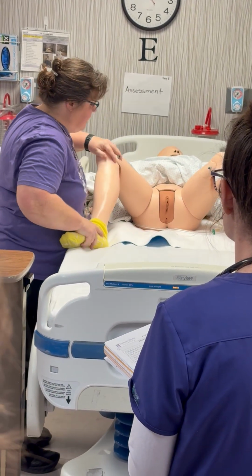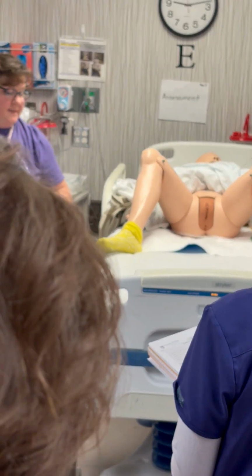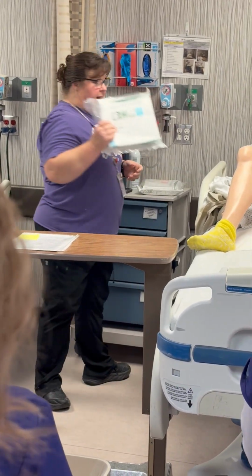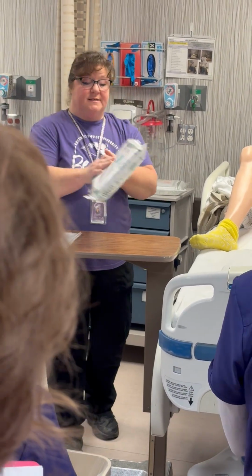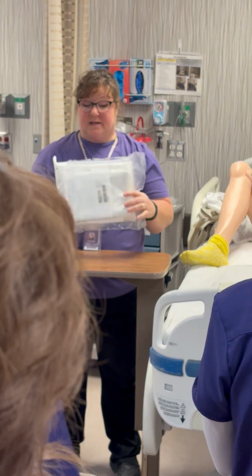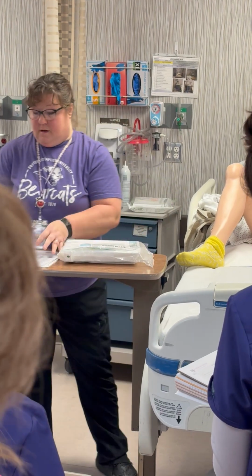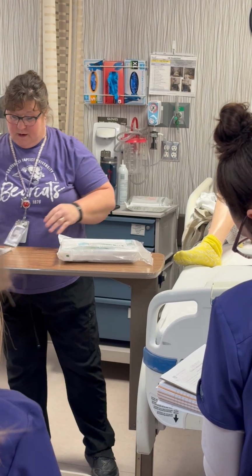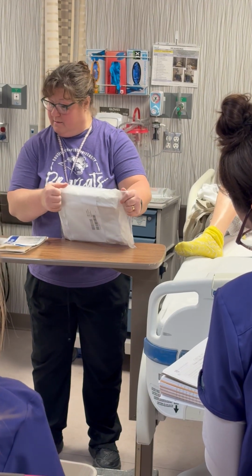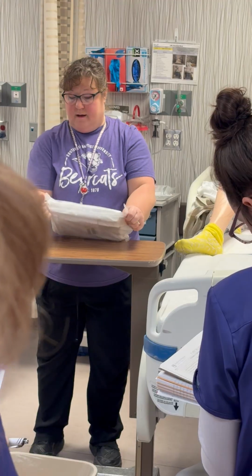Okay. All right, so now I'm going to make sure my table and everything is there, and I'm going to make sure I have the right bag, and it doesn't have any holes or anything in it. I'm checking the expiration date to make sure it's not expired, okay? All right, then it says, we're going to open up this catheter kit, okay?